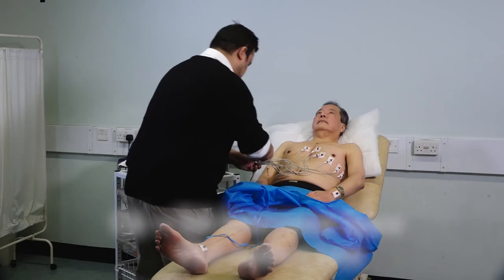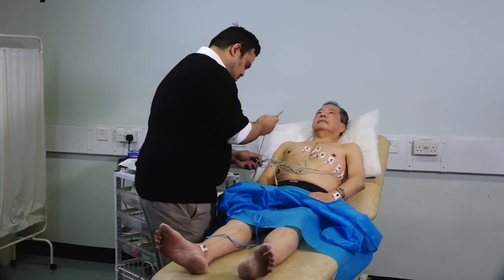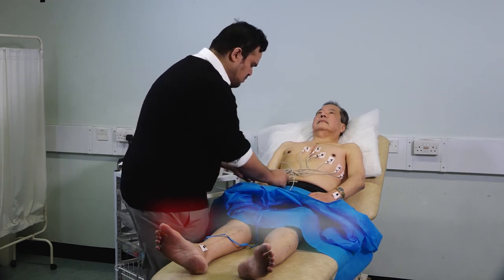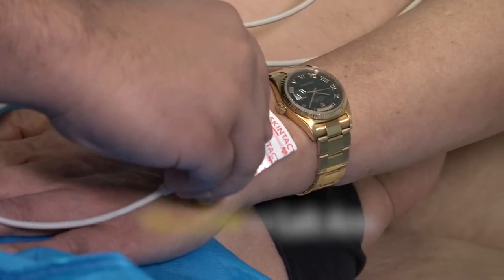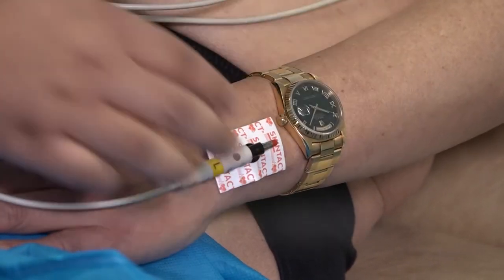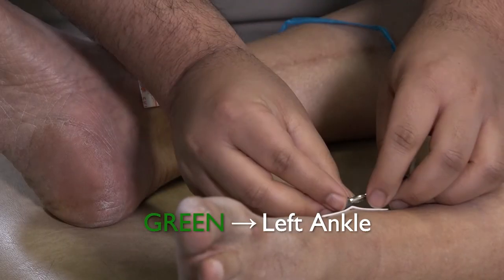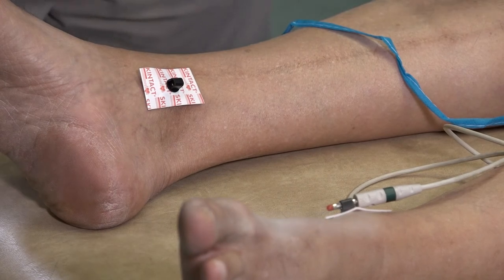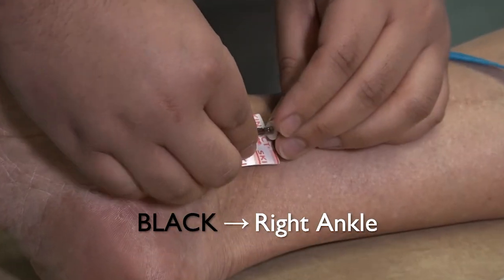Now attach the four limb leads: red to the right arm, yellow to the left arm, green to the left ankle, and black to the right ankle.